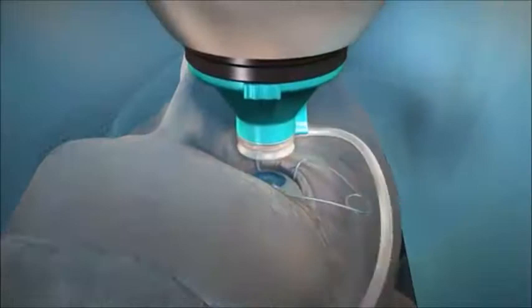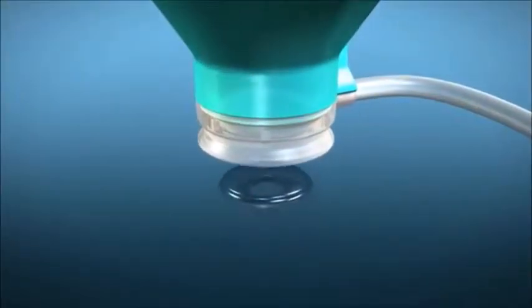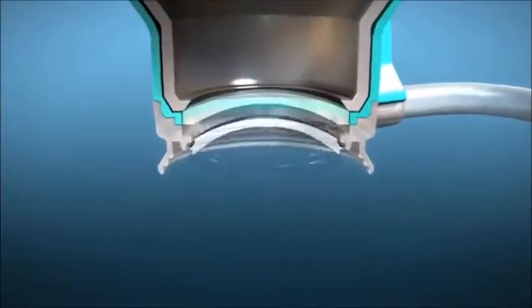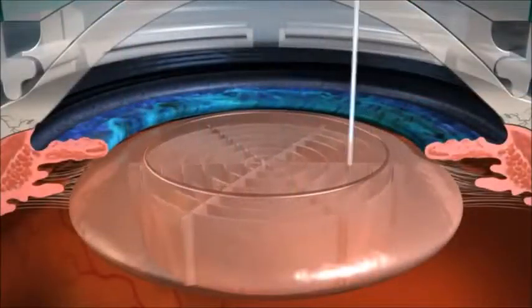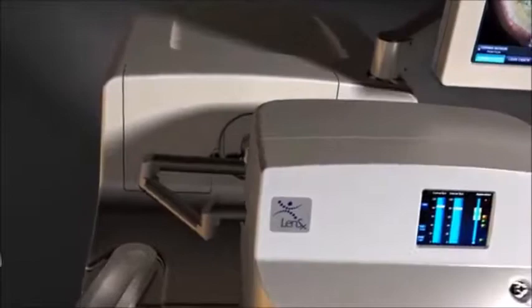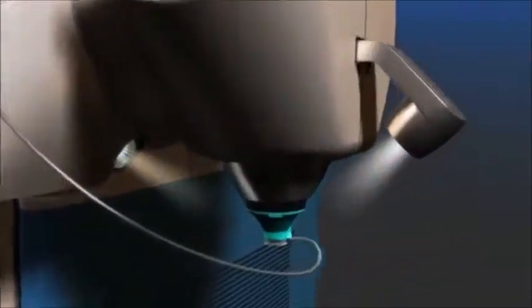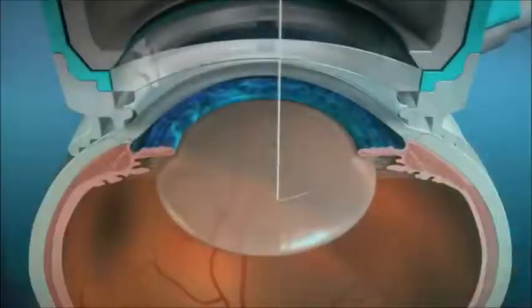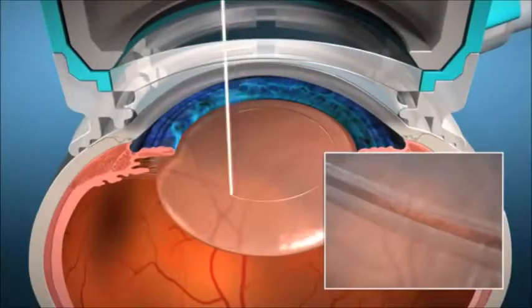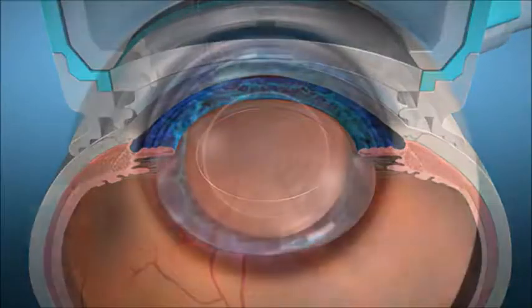With recent technology advancements in cataract surgery, surgeons now have options that allow patients to make informed decisions on how their cataracts will be removed. One such advancement has been the introduction of laser refractive cataract surgery with the LensX laser. The LensX laser is designed to bring a new level of accuracy and reproducibility to refractive cataract surgery by automating some of the most challenging steps.